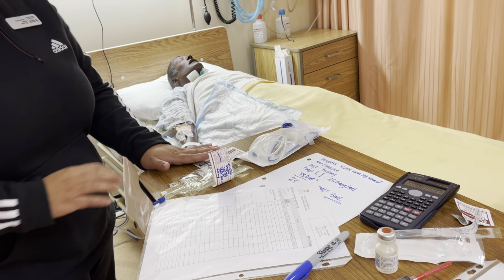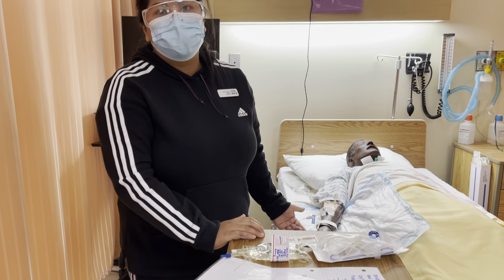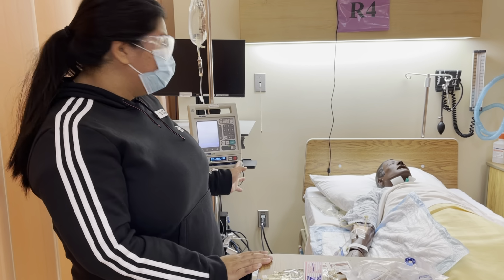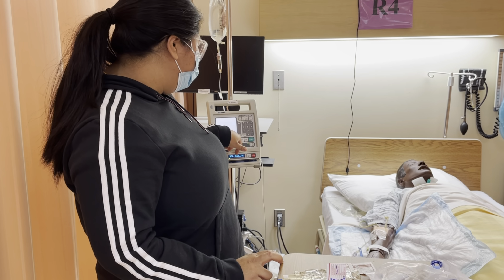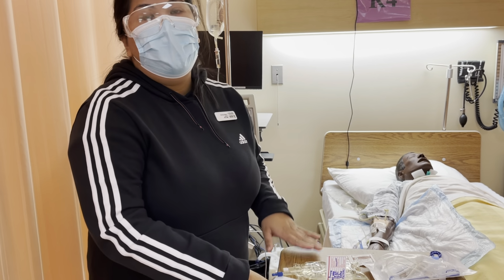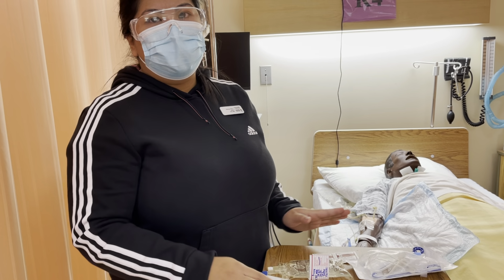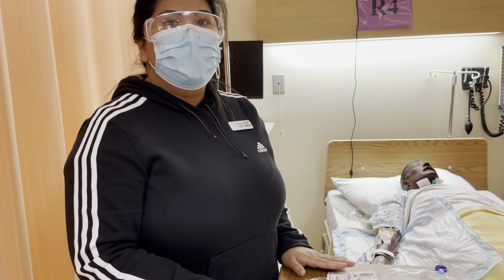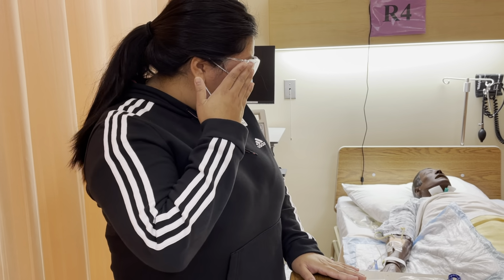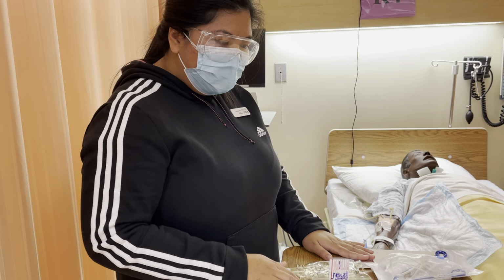So we'll also assess the IV site. So I'm making sure that the primary is infusing properly and it is set at the correct rate, which it is. And then I'll also assess for any signs and symptoms of IV complications such as redness, pain, swelling, bruising, bleeding. And then we'll explain our medication to our patient.